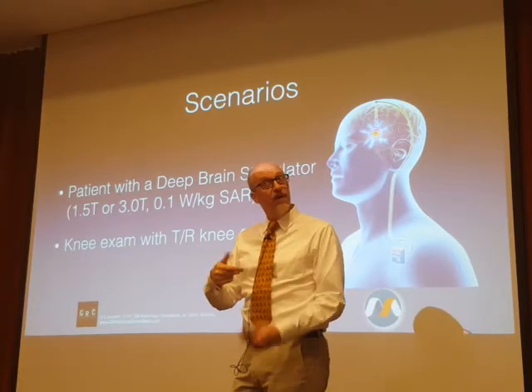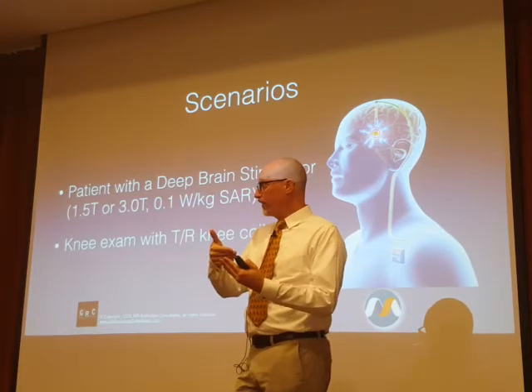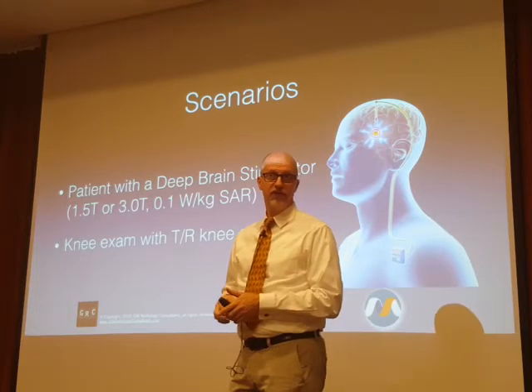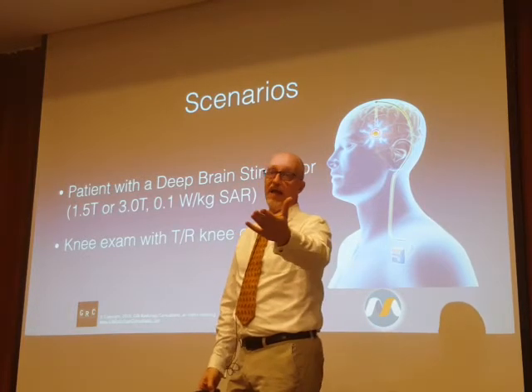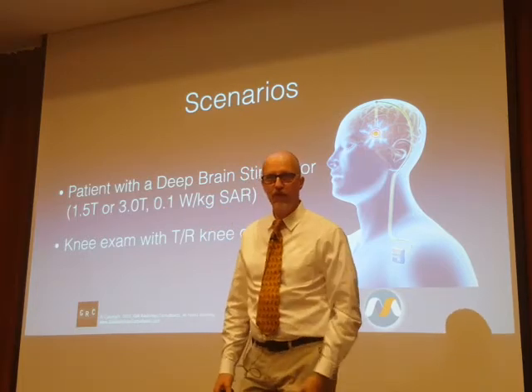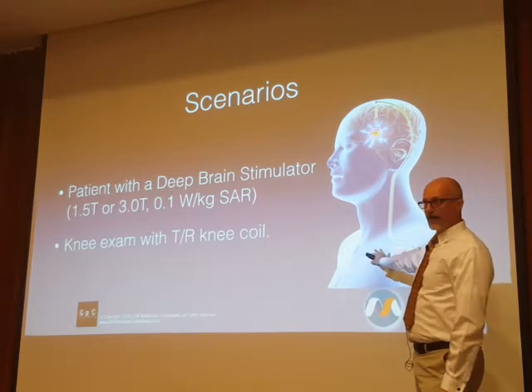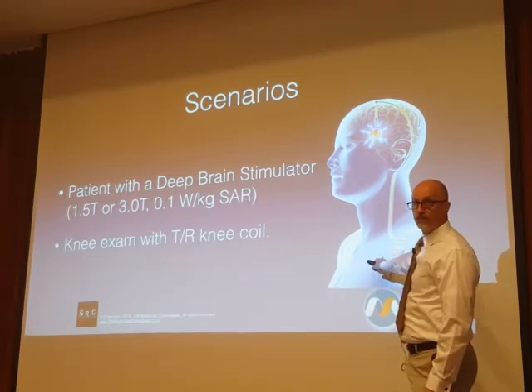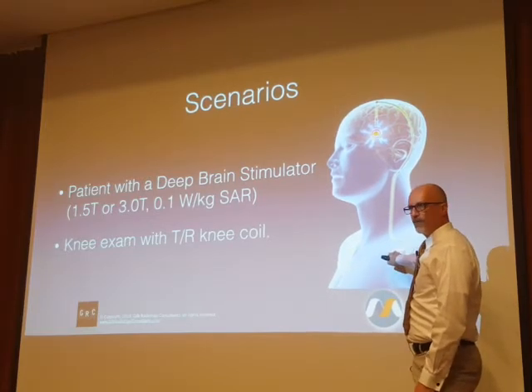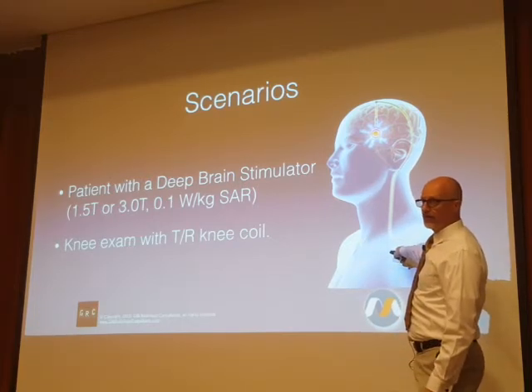If it's a short patient, we may actually be parking the implant at the mouth of the bore where that spatial gradient is the greatest. We would have passed through that, and so we would have exposed it to that if we were going in head first. So the worst case scenario is we're not exposing it to anything more if we have a short patient and we're parking this at the mouth of the bore. If it's a tall patient, if it's me, then the exposure to this will be less.